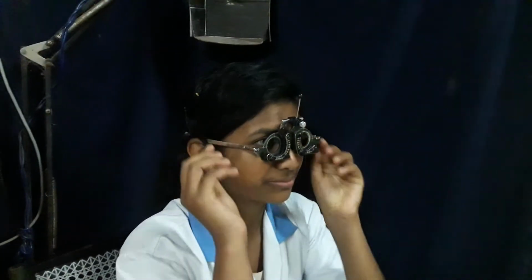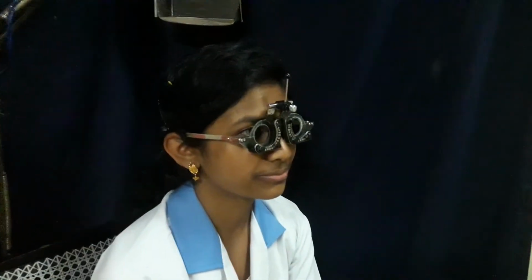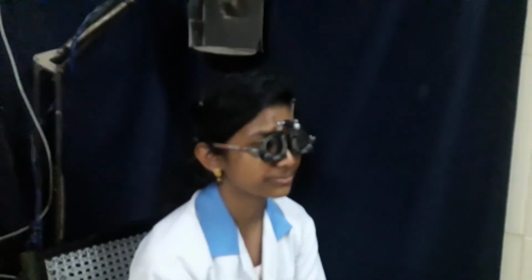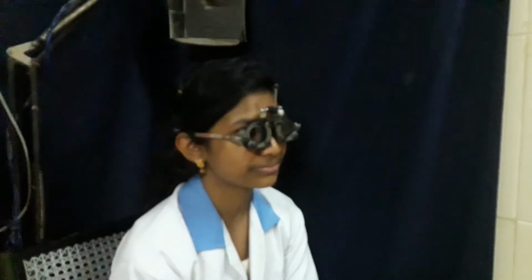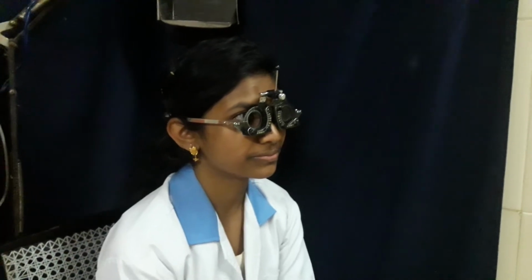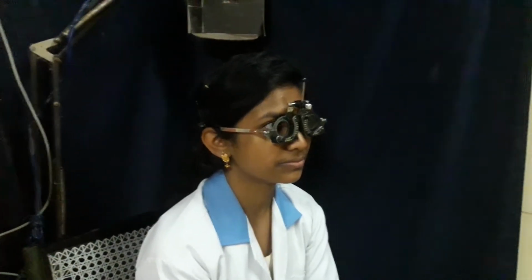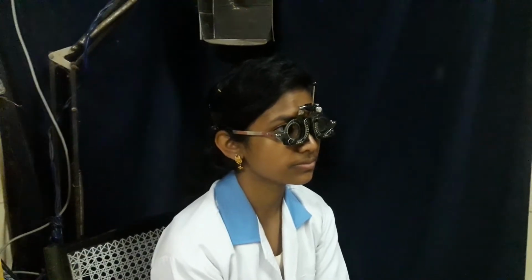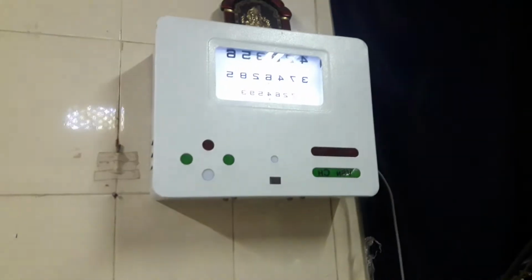For the vision recording is application of a trial frame. The patient is asked to apply the trial frame in front of the eye, and an occluder is used to close one eye. So the right eye is open now and the left eye has been closed with an occluder. So the patient looks straight into the Snellen chart.